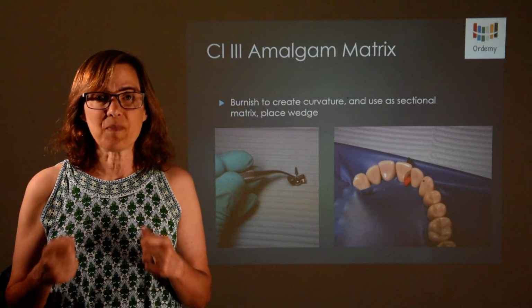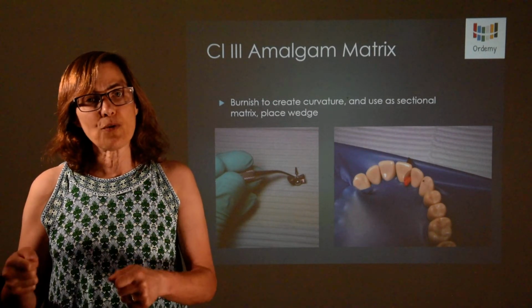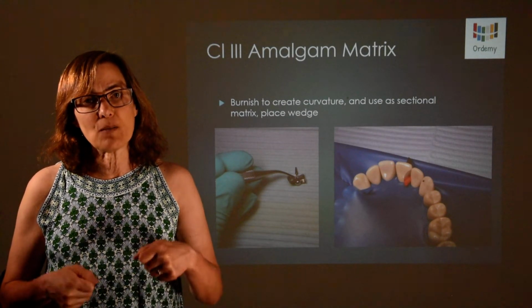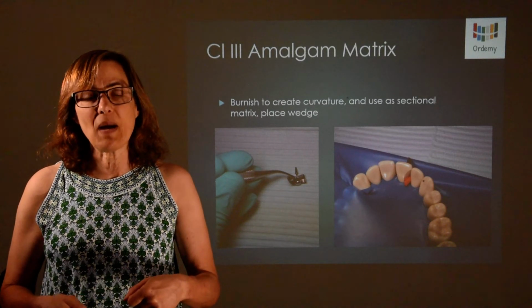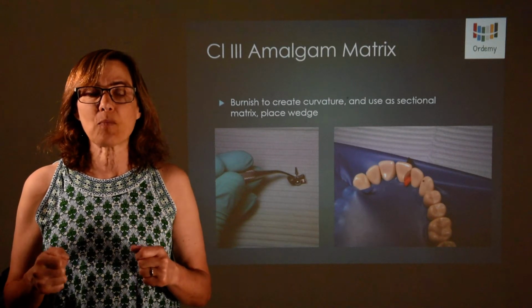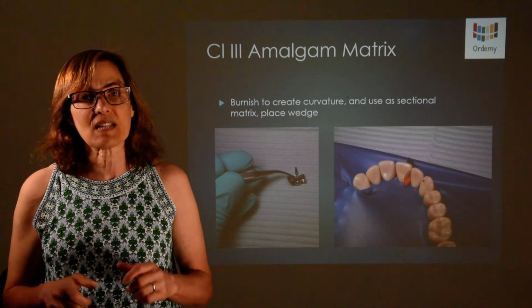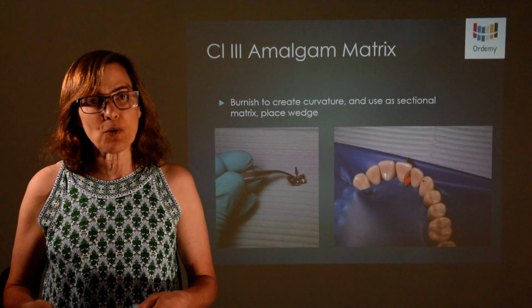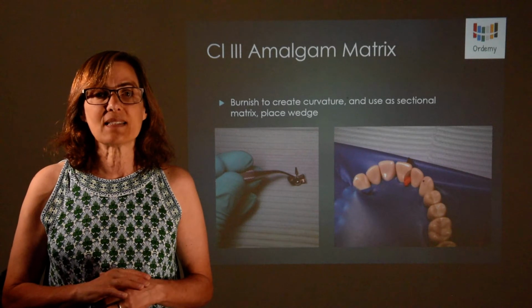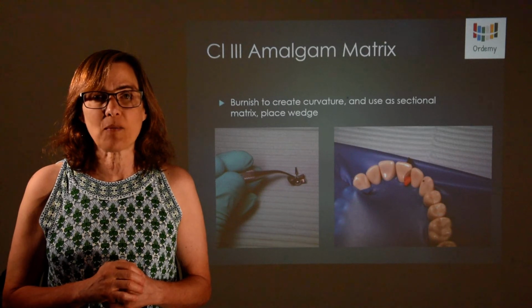You will take the floss, and rather than snapping it through the contact, you will seesaw through the contact. You go all the way down to the gingival margin, and you can burnish the amalgam against the tooth. But at that point, the floss does not come back through the contact point, because you can actually open the contact point by flossing it too vigorously. So once the floss goes through, either remove the floss facially or lingually, and at that point you should no longer touch the contact point.